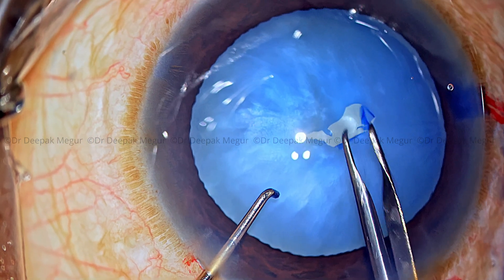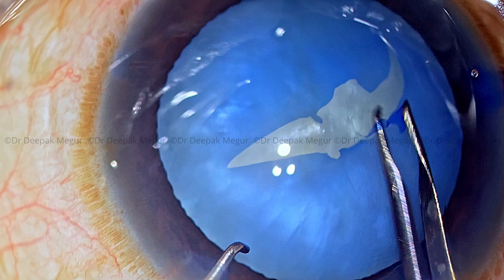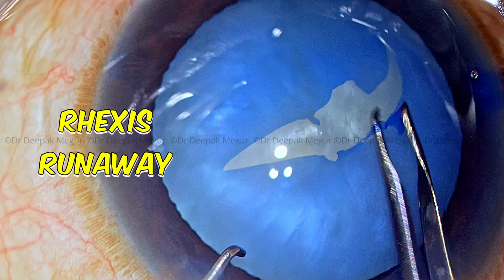We're all aware that rhexis creation is very challenging in eyes with intumescent lenses. There is a higher risk of rhexis running away to the periphery and sometimes even having the Argentinian flag sign. Do all the intumescent lenses behave the same way? So let's discuss a little bit.